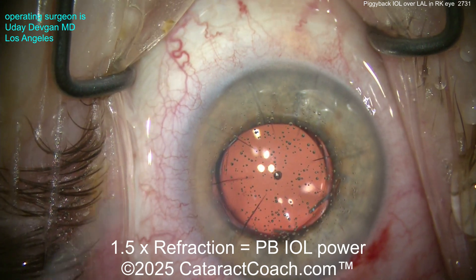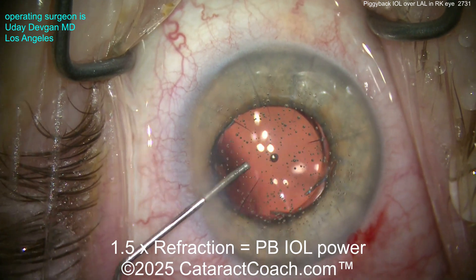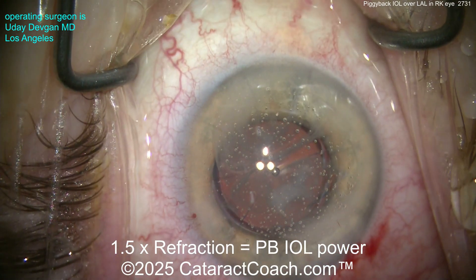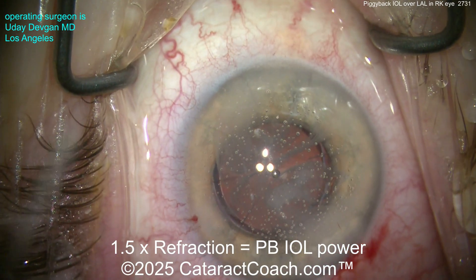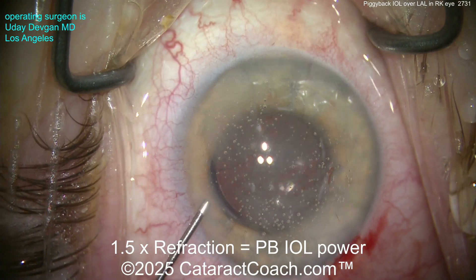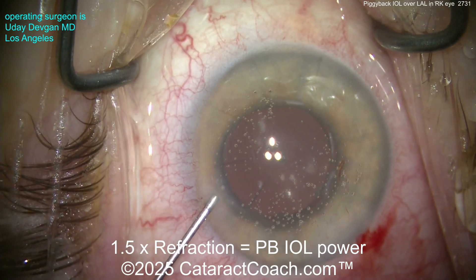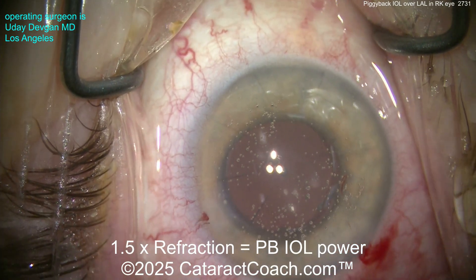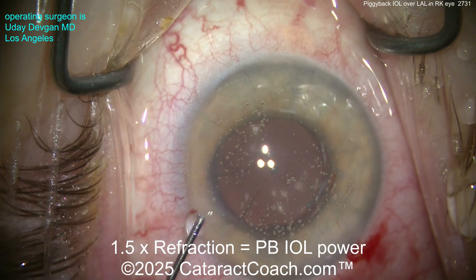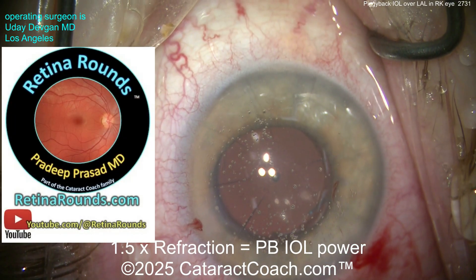Here we're placing the lens, and notice we also put in some mild miotic to bring the pupil down — you definitely want to bring the pupil down. Here's some triamcinolone to help quell any post-op inflammation. Those bubbles you see are just champagne bubbles — just kidding, they're air bubbles and they'll resolve soon.